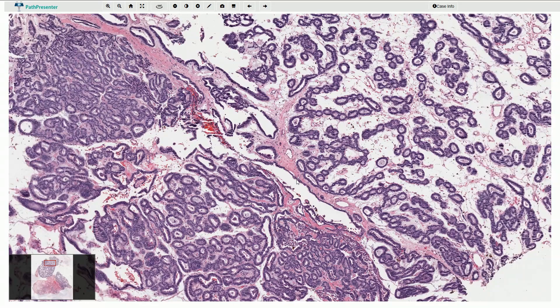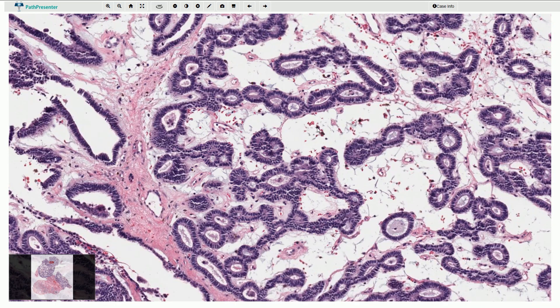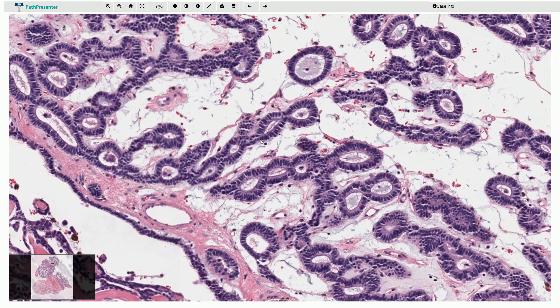The tumor typically shows canalicular architecture. In this part we can see the very typical arrangement which is called beading. The cells form these elongated canaliculi where in some places the cells are very close to each other, with a regular widening and narrowing. We can see it here as well, and it creates this bead-like pattern. Also here — narrow spots and wider canaliculi.